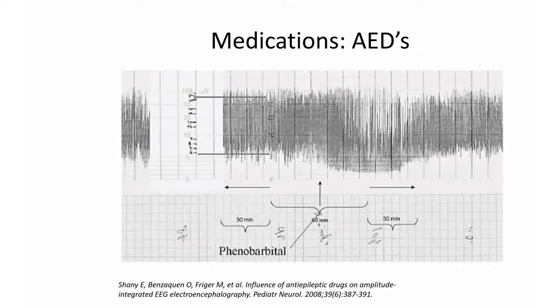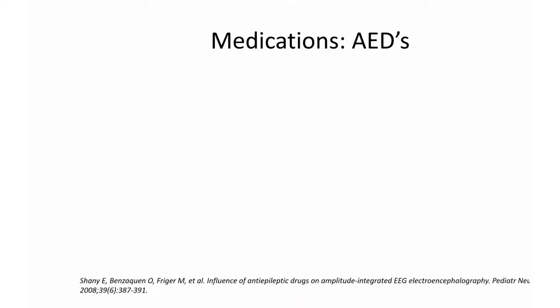This is, to me, a pretty healthy brain, not only because it was healthy before the dose, but then the quick recovery, 30, 45 minutes of a lull in activity as you're hitting that upper maximum concentration and distribution in the body. And then the brain kind of is, okay, that's fine. We're at steady state now, I'm good. The sicker the brain, I find you give that loading dose and it never comes back up. So that's just my personal experience with that.